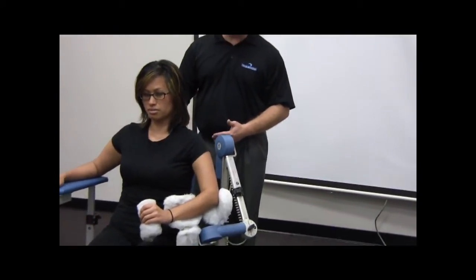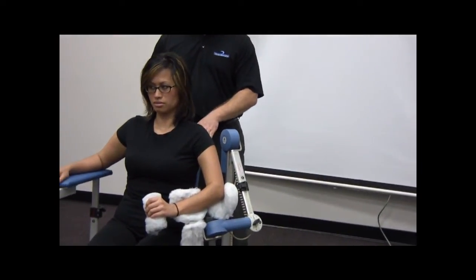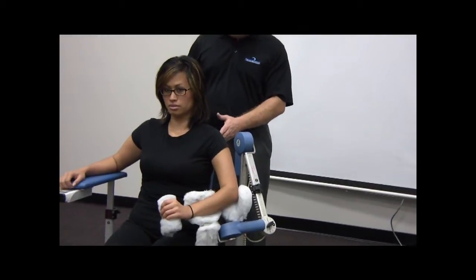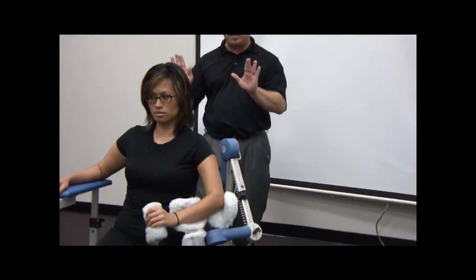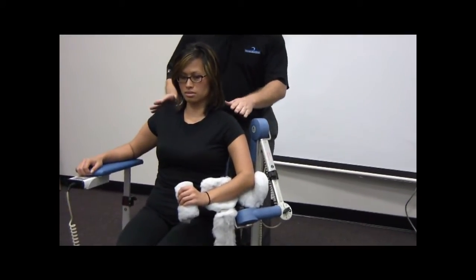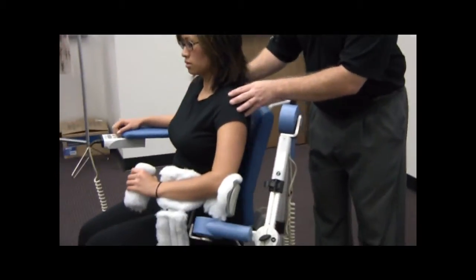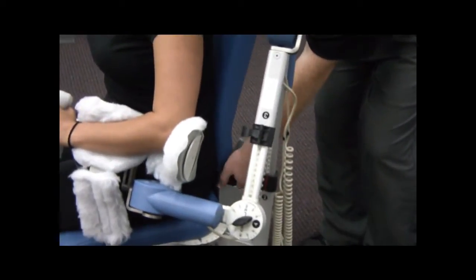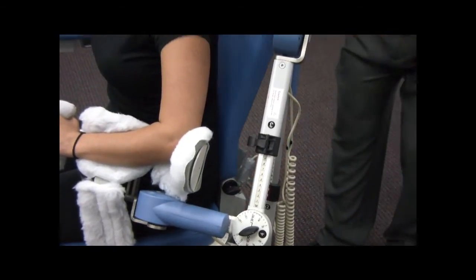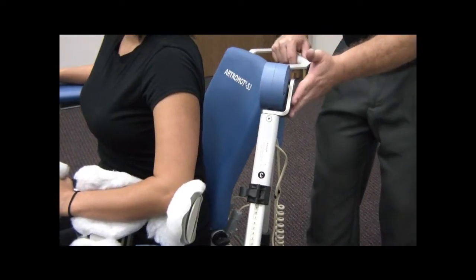with the angle of the back of the chair, okay? Typically, where I have it is the most comfortable spot. However, if she would be more comfortable, we can lean the chair back or we can lean it more forward. I don't think she would be more comfortable leaning forward, but I'll ask her to lean forward off the chair. This knob here, right along the side of the chair, if we loosen that, we can scoot back or we can move forward.